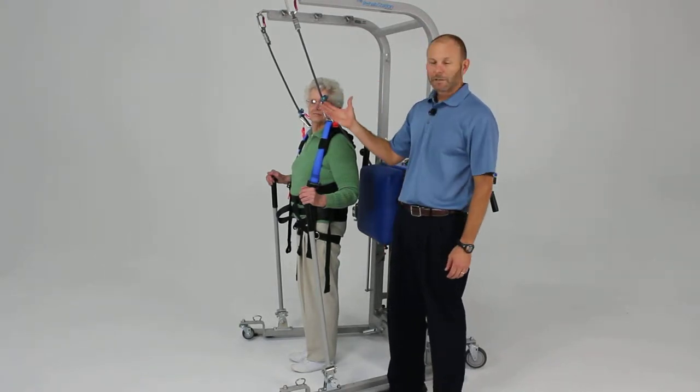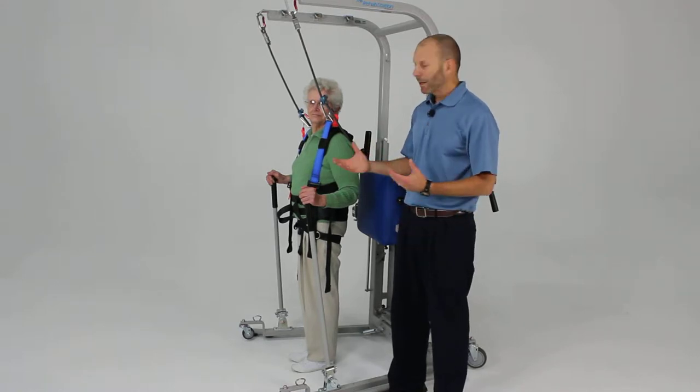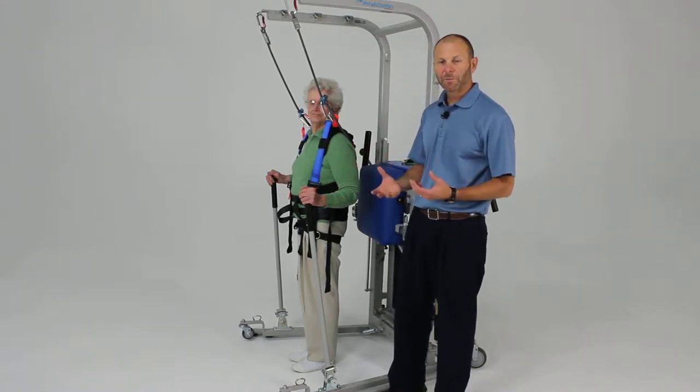One nice feature: the rehab station allows you to provide a safe environment for exploring more dynamic activities such as plyometrics and faster movement activities.